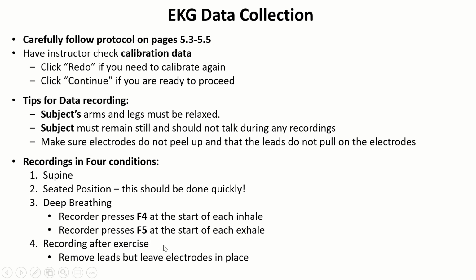The final condition is a recording post-exercise. Your subject will take off the leads, but will leave the electrodes in place for this time, and they can jog up and down the hallway, they can do push-ups, they can do jumping jacks. They just need to get their heart rate elevated for a couple of minutes. You again want to make sure you start your recordings very quickly after they come in from exercise to get the most accurate data.